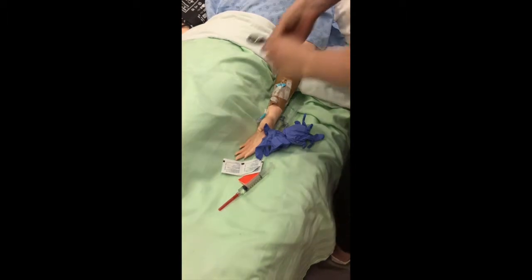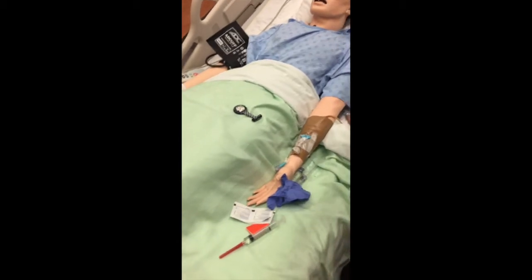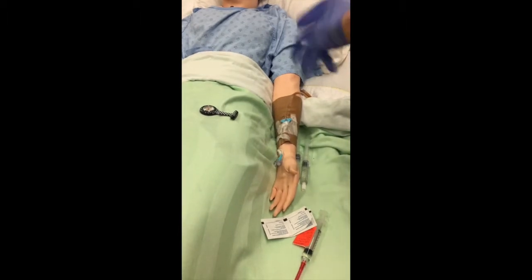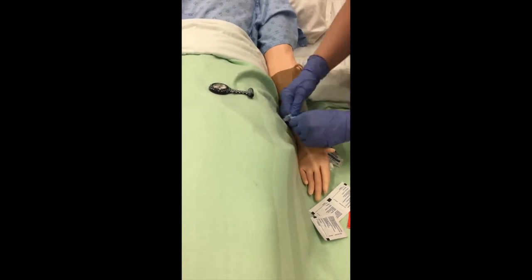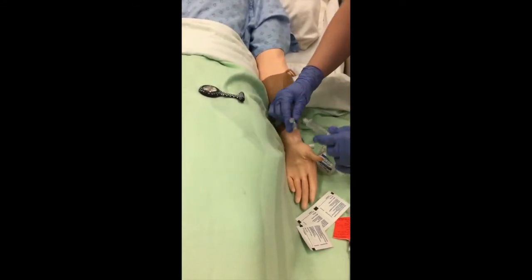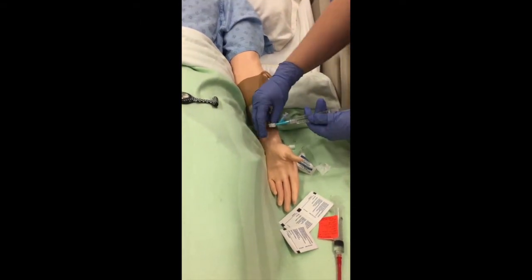Evelyn, do you mind if I just lay this watch right here so I can check, make sure I'm giving it over the right amount of time? And she'll say, of course. Okay, so the first thing I need to do is check the patency of her IV, because it's not a running IV right now. So I'm going to swab both ports for 30 seconds. I'm not doing it for 30 seconds in this case, due to time's sake. And then make sure I've got my posi flush and its seal has been broken. So I'm going to insert this here and make sure this is unclamped.